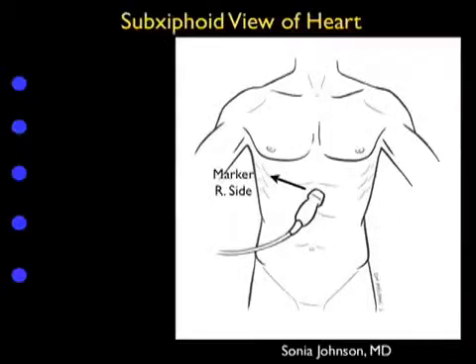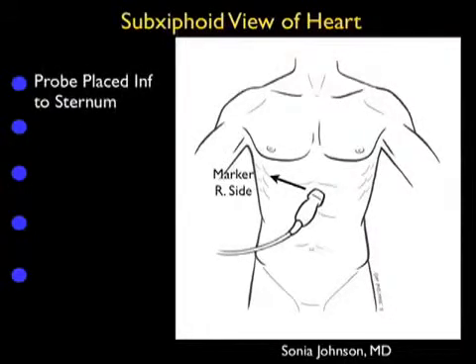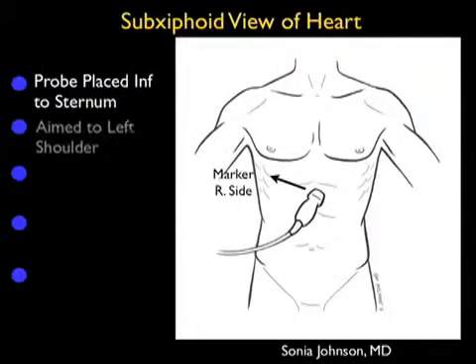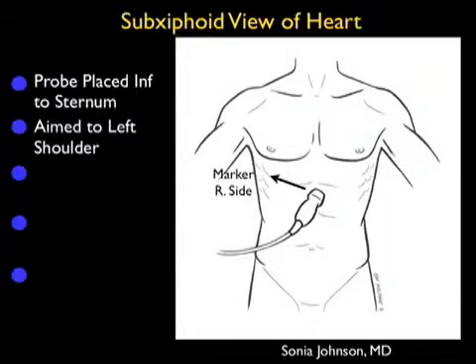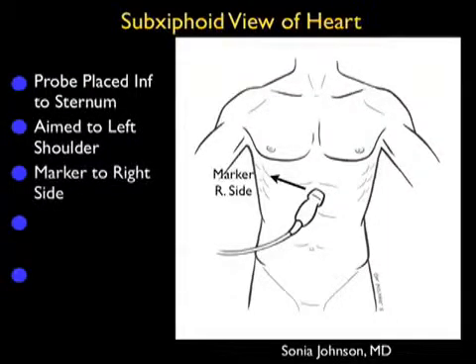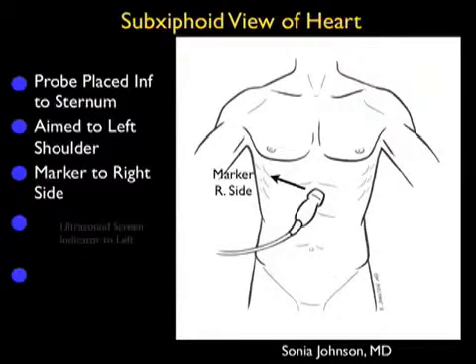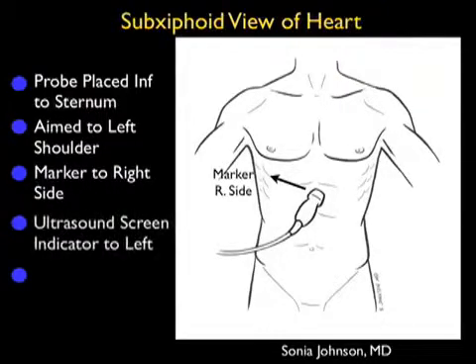Now let's learn how to perform the subxiphoid view of the heart. As shown in the pictorial to the right, the probe is coming from an abdominal position, placed just inferior to the xiphoid tip of the sternum. It's important to lay the probe flat and push down and under the sternum, aiming towards the patient's left shoulder.